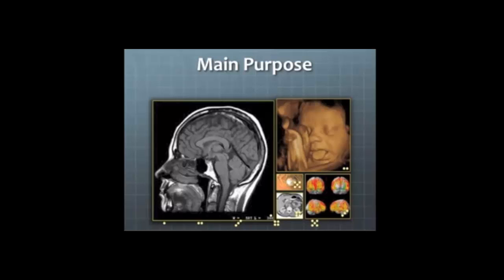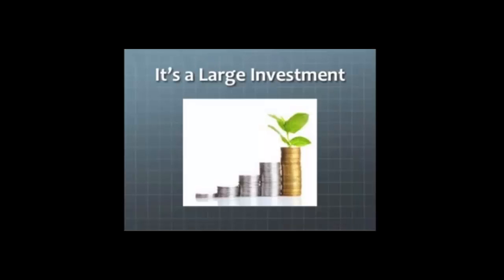PACS handles images from various medical imaging instruments like ultrasound, magnetic resonance imaging, positron emission tomography, computed tomography, endoscopy, mammographies, and computed radiography. Implementing PACS within an institution is a large investment. PACS can be purchased from a variety of medical imaging vendors including GE, AGFA, and Siemens. The most efficient and effective PACS solutions support all diagnostic imaging modalities.